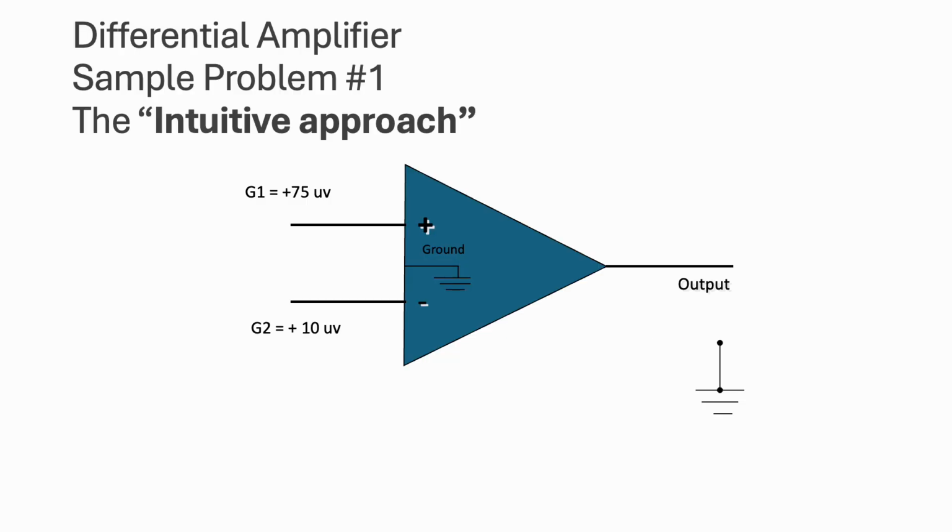There are a couple different ways you can think about this problem: the mathematical way, and the intuitive approach. We can think to ourselves, is the explorer on the mountain or under the ocean? And then, is the explorer higher or lower than the reference voltage? Which then leads to which way does the pin deflect? And then finally, what's the difference between the explorer and the reference?